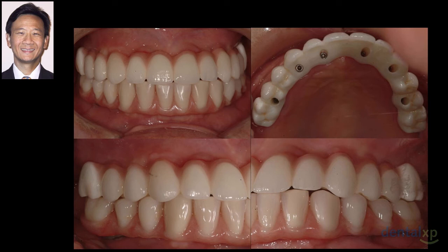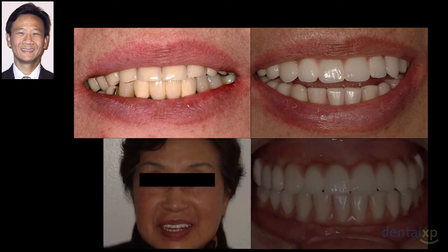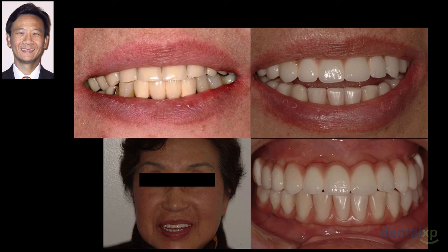We did this protocol knowing that where we would have to replace that mandibular arch or the denture teeth, rather than having the common materials and having to replace both arches, we would just have to replace one arch. Again, taking our patient from before through to the definitive prosthesis 8 years later with her smile and prosthesis in place.